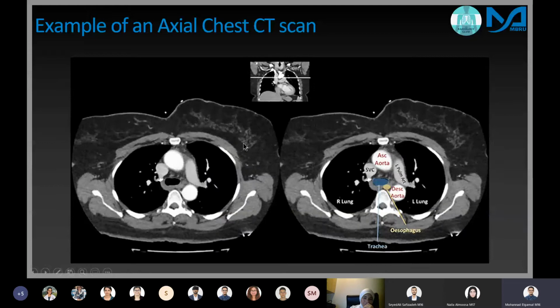All right, so here's a great example of a chest CT, and it's on the right. You'll have it labeled if you're a little lost. With an axial plane like this one, you might feel a little bit lost, but there are definite anatomical features that help identify where you are. So right now, can anyone guess which vertebral level we're at? If this is too advanced, then it's okay. Use the tissues and the structures around to tell which vertebral body this is most likely to be. I'll give you a few seconds for that, and then I'll answer.